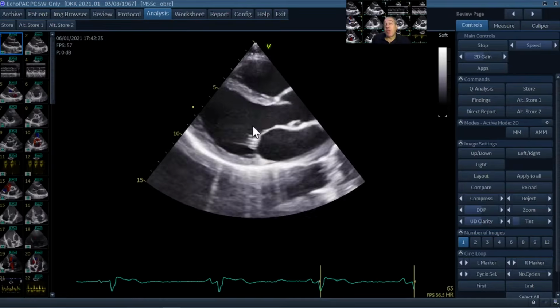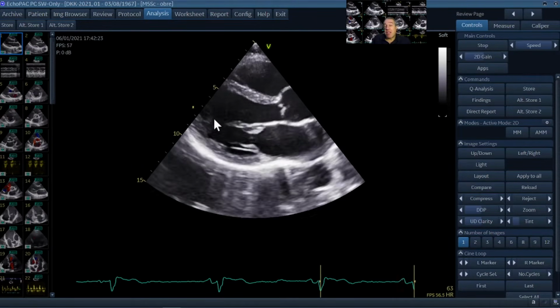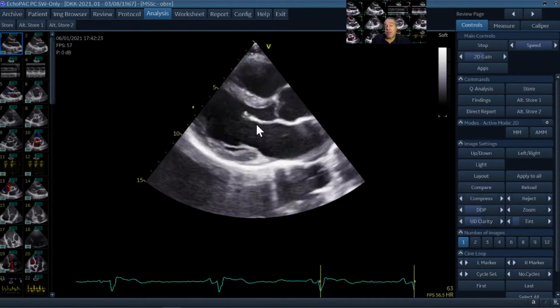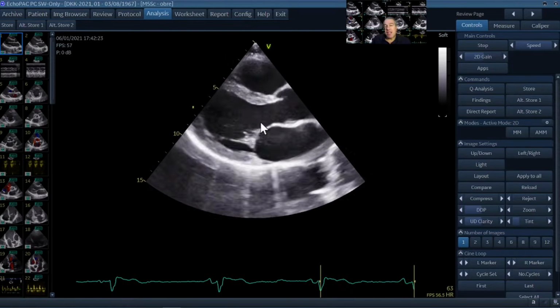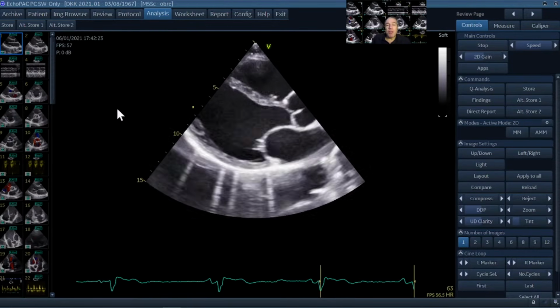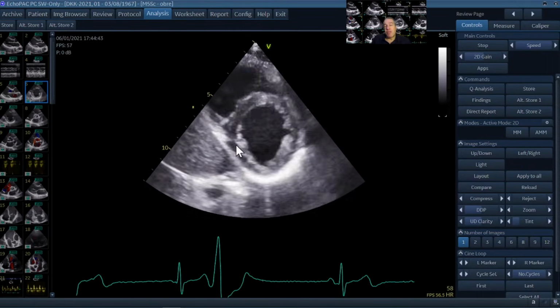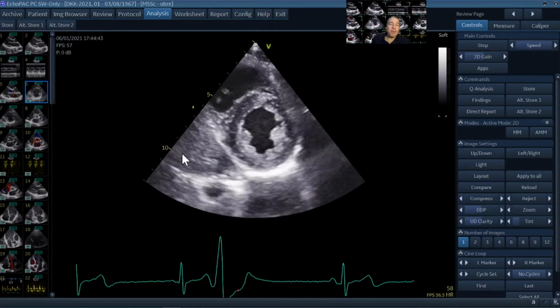But in the normal ventricle, the posterior placed papillary muscles prevent the obstruction of the outflow tract by the anterior mitral leaflet. So I think that's the anatomic reason why, if we look at the short axis views, both papillary muscles are more posterior than anterior.